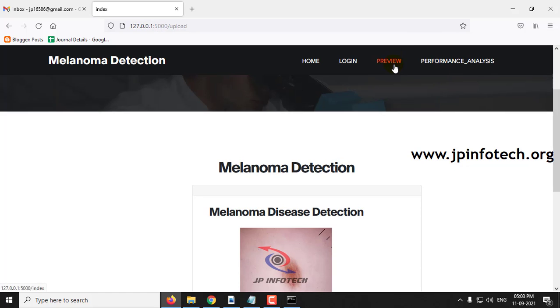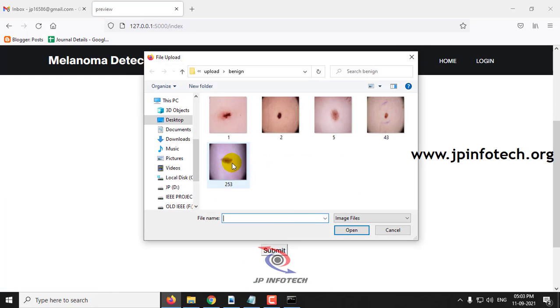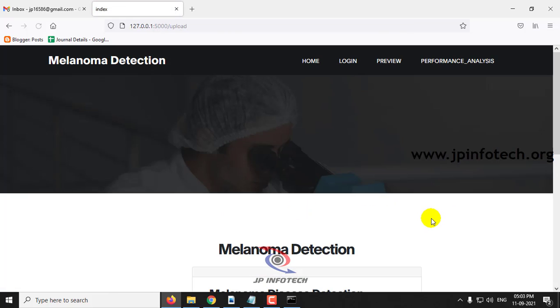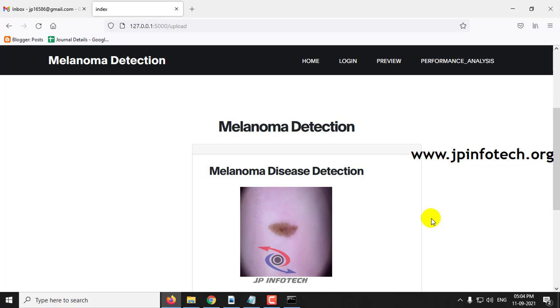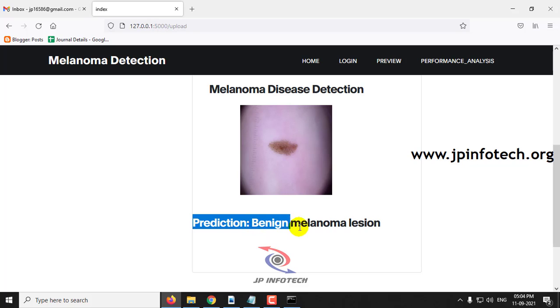Let me go to the preview part and select another image and click submit. Now you can see the predicted result for the uploaded image — the prediction result is Benign melanoma lesion.